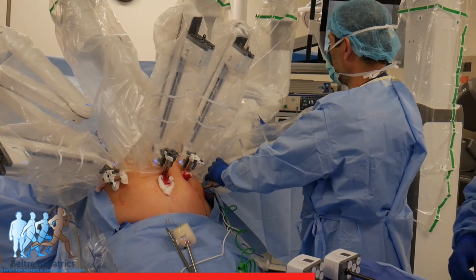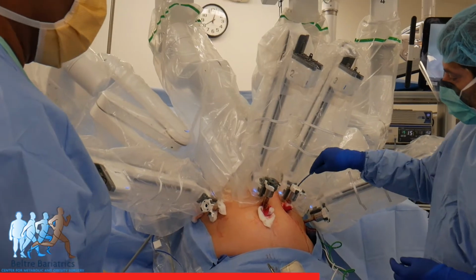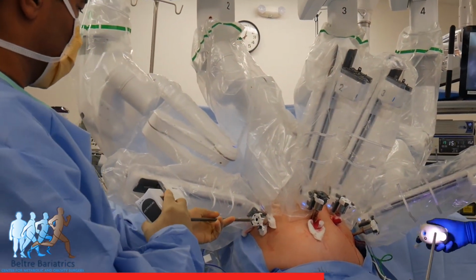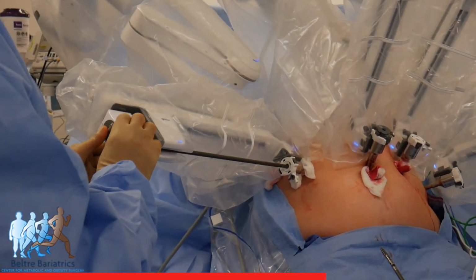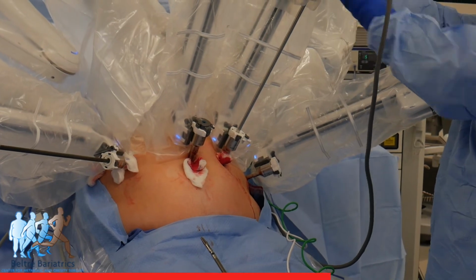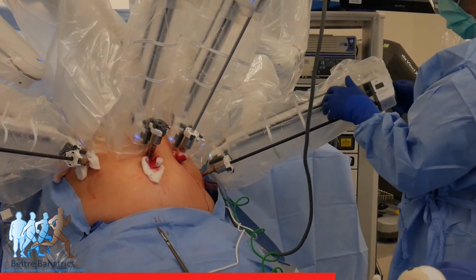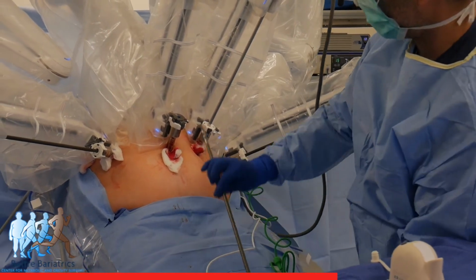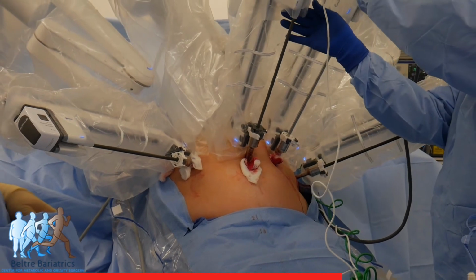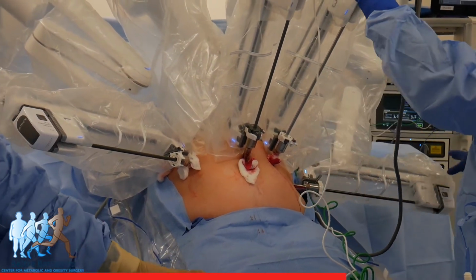The abdomen, of course, is inflated with CO2 to give us the space to work. And you can see now how we take different instruments. That's one of the instrument graspers that I use. Now that's parked there. And take the cameras and the different instrumentation. Ahí pueden observar cómo estamos cogiendo los diferentes instrumentos y ahora montándolo a la mano del robot. Estos son los instrumentos que voy a estar controlando. Como dije antes, el robot no hace nada a menos que yo no lo esté haciendo.